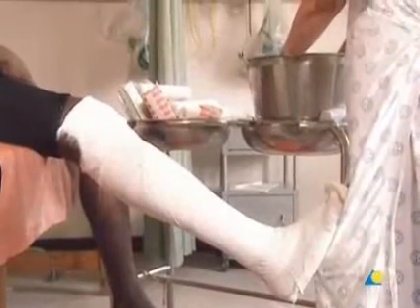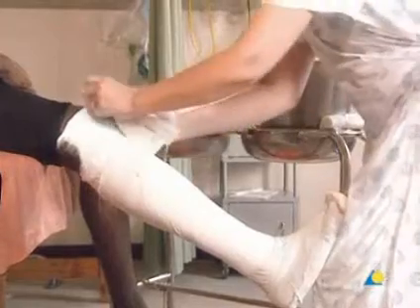The end of the second plaster bandage is folded over to form a slab. The bandage is wettened and the slab is placed over the patella. The bandage is wound down and around to the proximal posterior border, and then upwards and around to the patella. Winding continues towards the foot and over the heel.